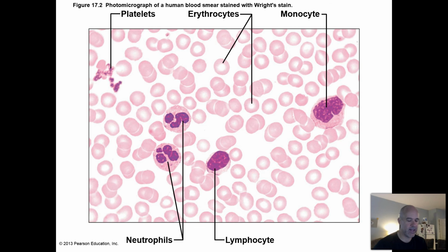All right, so here's an example blood cell stain, like what you would look at if you were using a microscope in the laboratory and you went up to the highest magnification that we have available with our microscopes in the lab. This is what you would wind up seeing. Now I mentioned that there's a combination of blue and red dyes that are typically used on the slides that we have in the lab. There are other types of stains that can be used as well, so I know you're not seeing as much bluish purple color on this particular image from your textbook, but it is highlighting for you that these different cell types have different appearances.